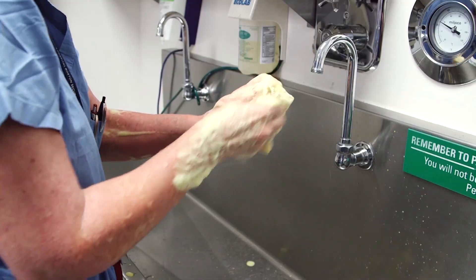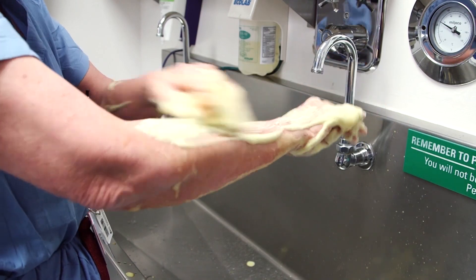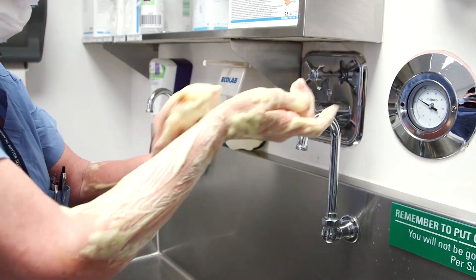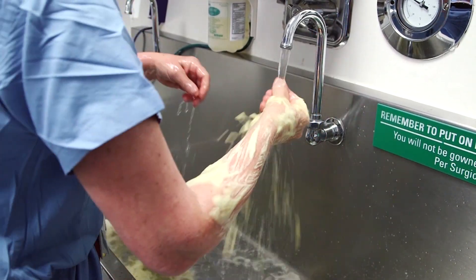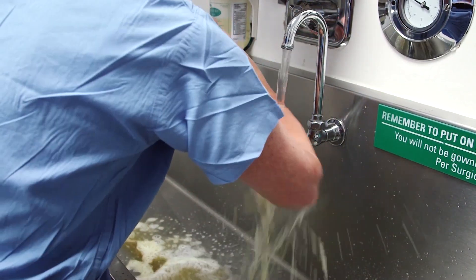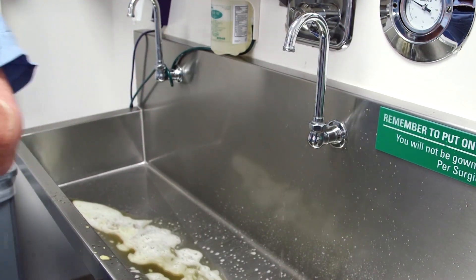After both hands have been scrubbed, the forearm should next be carefully cleaned in a circumferential manner. When washing the antiseptic off, it should be done starting from the tips of the fingers, then progressing toward the forearm. This prevents the water from the forearm from running back into the hands and contaminating them.